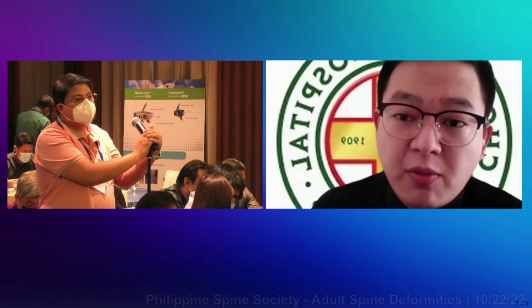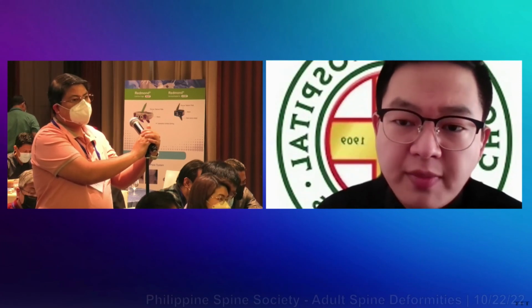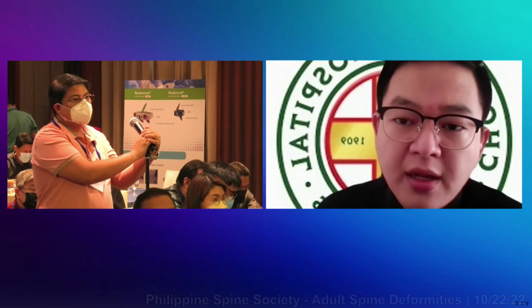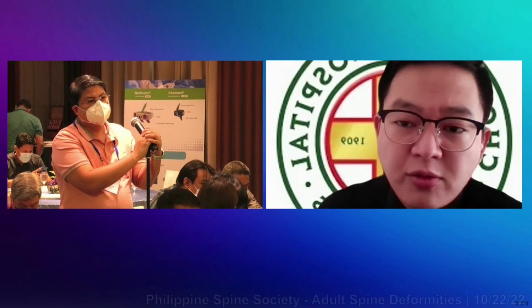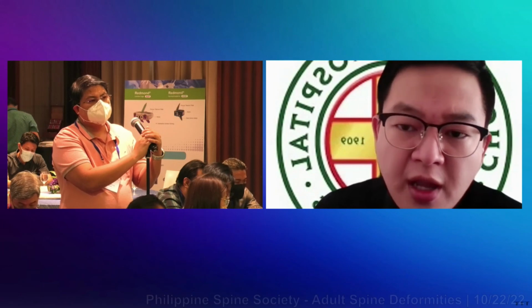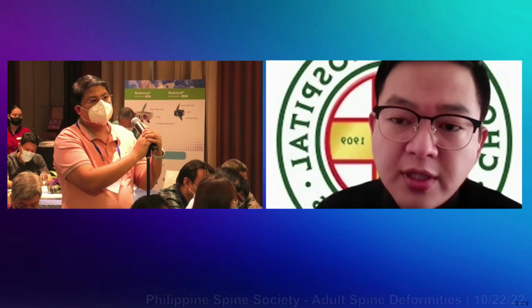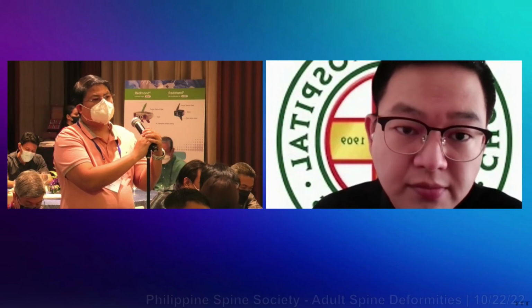Actually, this patient underwent a few sessions of radiation therapy after post-op, and a good thing is that after radiation, the construct is still intact with no signs of any implant loosening. Regarding the question, what else can be done to prevent implant failure for patients who underwent or will go through radiation, I think doing a robust construct with additional fixation points could somehow prevent implant loosening from radiation. Thank you, thank you.